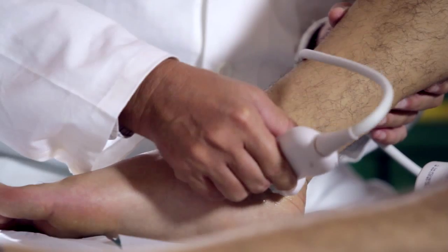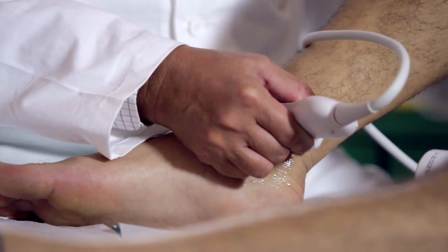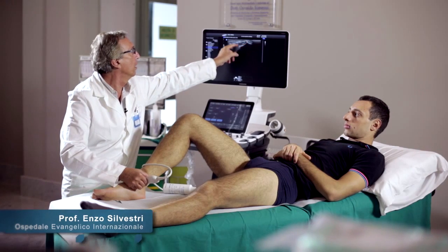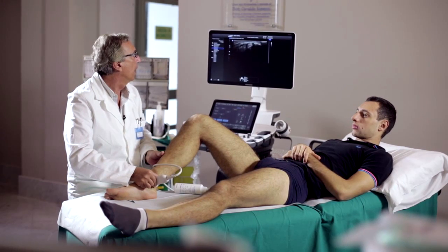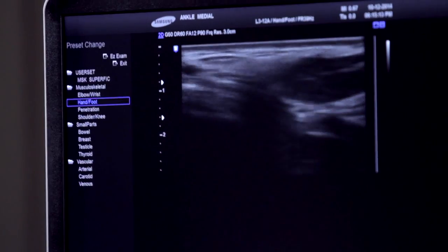We scan on the back of the ankle joint to display a first structure which rests directly on the tibial malleolus. This is the posterior tibial tendon. This tendon is very large, and it follows the malleolus in its morphology. It then moves up to the front at the level of the insertion in the medial surface of the tarsal navicular.